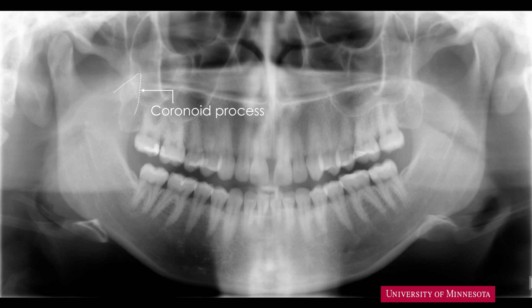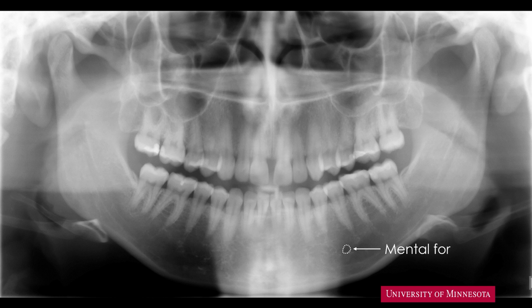Inferior to the sigmoid notch, we can see the parallel lines of the inferior alveolar canal, or the mandibular canal. In this image, the anterior part of the canal is challenging to identify. In many panoramic radiographs, the canal is quite easy to identify, though in many images the outline of the canal is quite faint. On the left side of the mandible, we can see the circular mental foramen. On the right side, the foramen is not adequately visible.